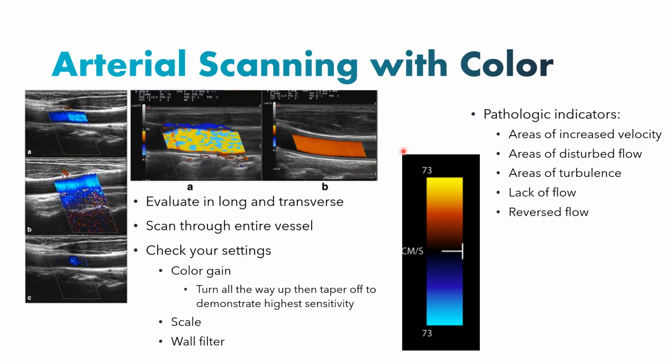So if the blood is flowing towards those scan lines, in this direction, they're going to crash into each other and indicate a Doppler shift, a positive Doppler shift like we talked about last week, which will be indicated in forward flow. Since red is above the line, in this case, this is all showing that blood is flowing cephalically in this carotid artery, or from the heart to the brain.